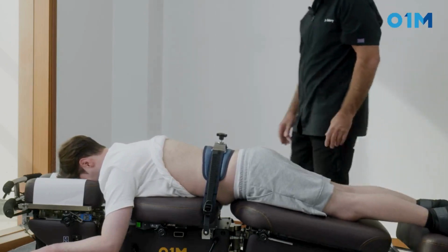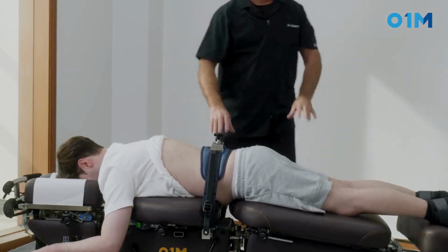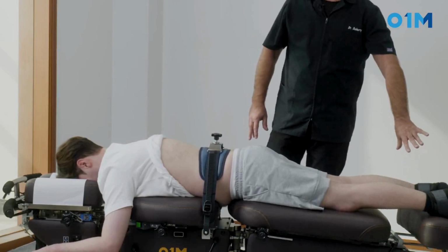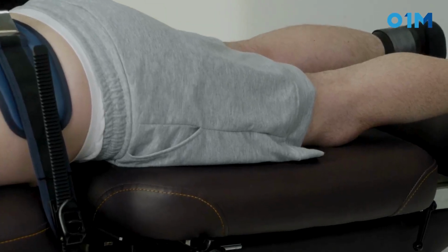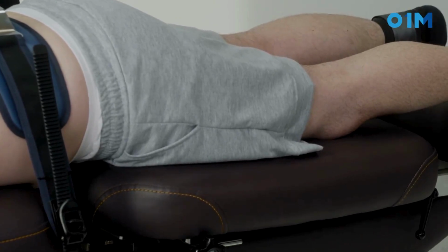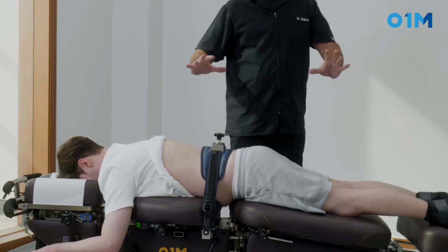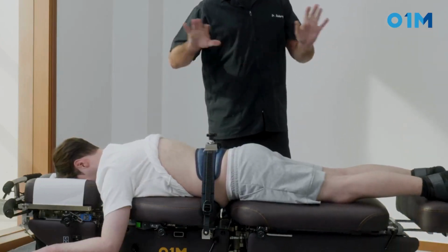How does it feel? Good. So we have attached him here. We have put an attachment on the ankle, and basically here we have not put any actual traction, but we can put a bit of actual traction initially and then bring the flexion. So very often what we will do, we put the traction to tense the body, then we set up our thing, and finally we go in flexion.